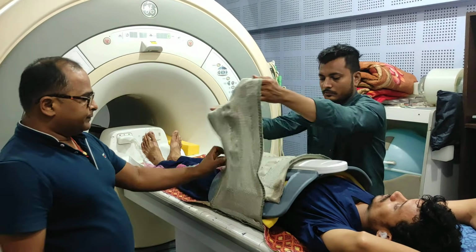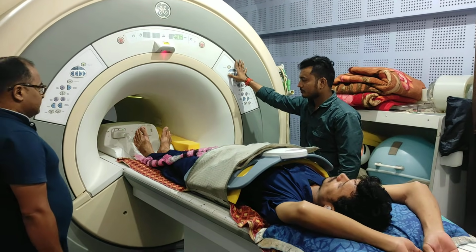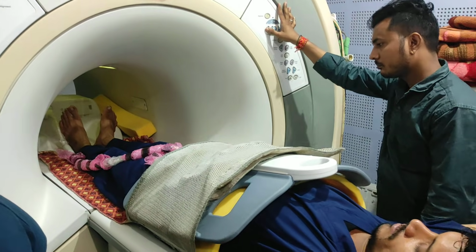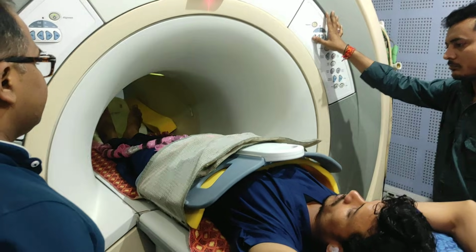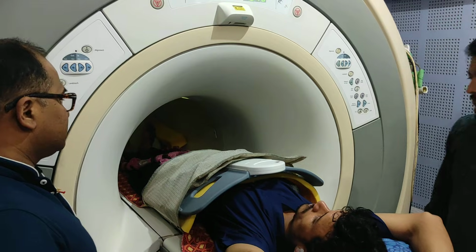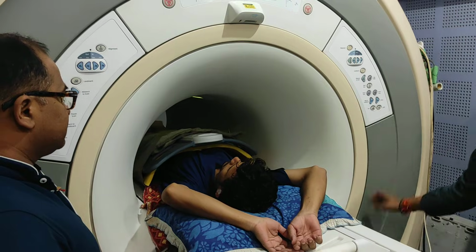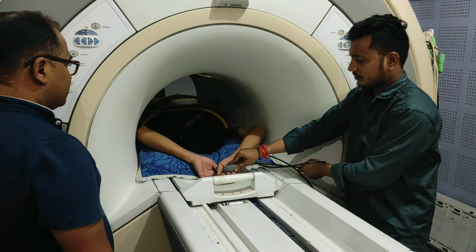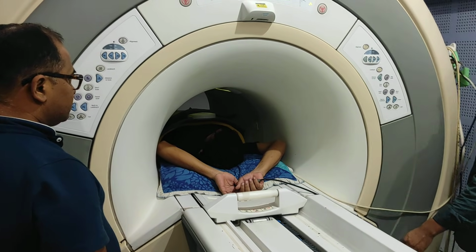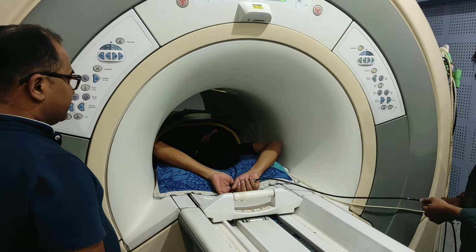Now you have to center. Now you have to give the position. You have to center the area of scan. This is the indicator light. Light on. And you have to give this emergency alarm to the patient. If they are having any problem, they will click that.